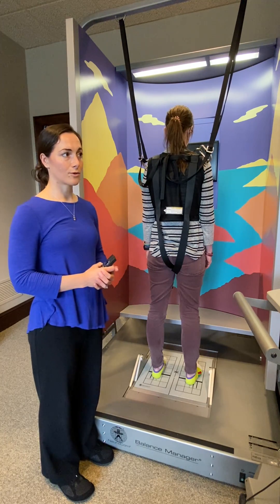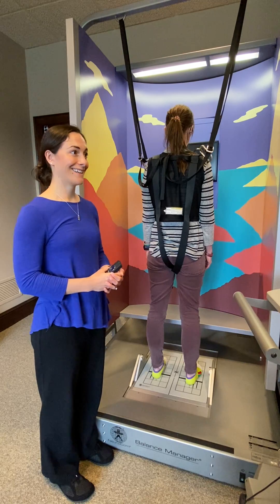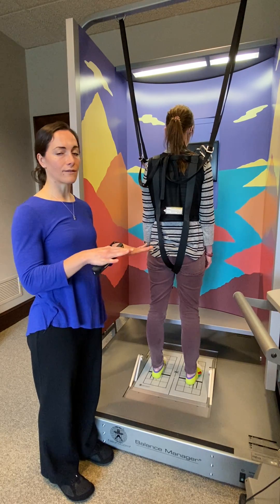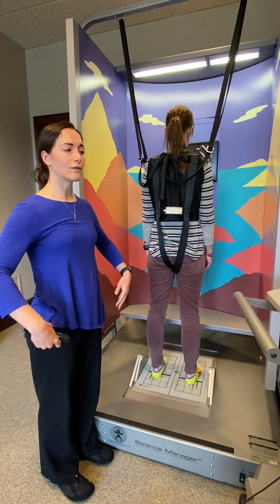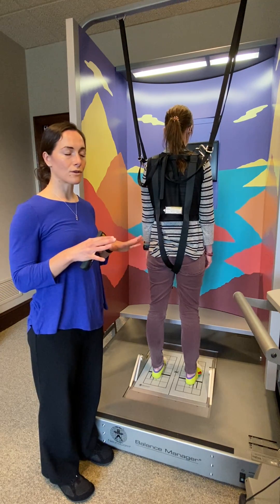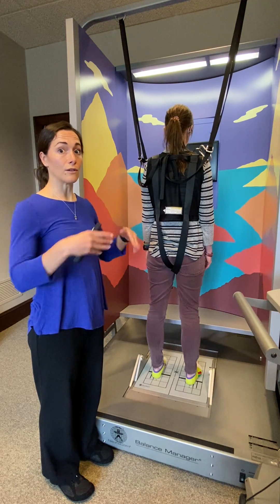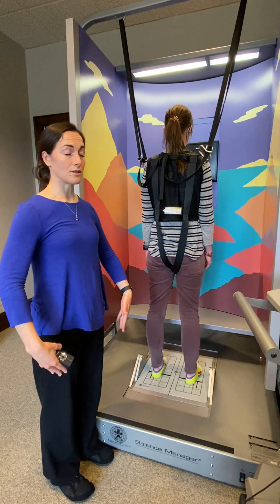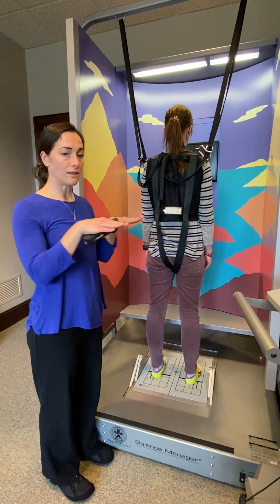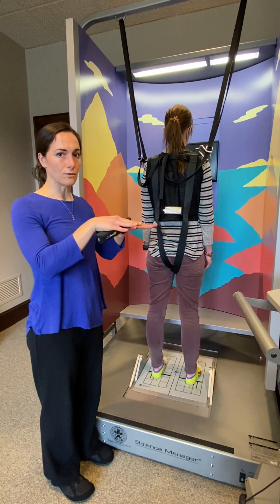This is the motor control test portion of computerized dynamic posturography balance testing. With this test we're assessing the function of the peripheral nerves — the nerves going from your spine down your legs and back up — to see if those nerves are giving your muscles the right messages they need to respond to changes in your position relative to what's under you.